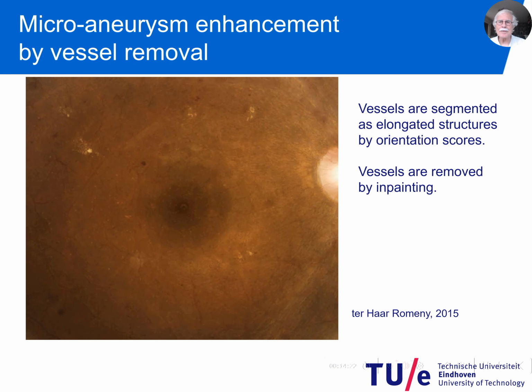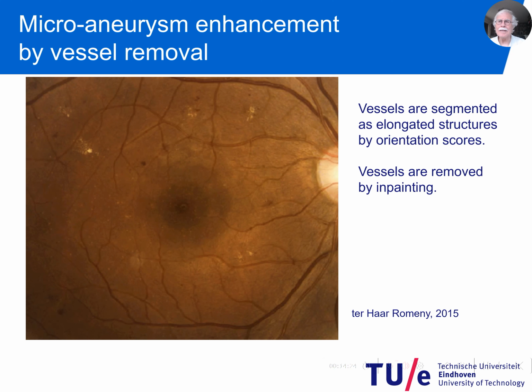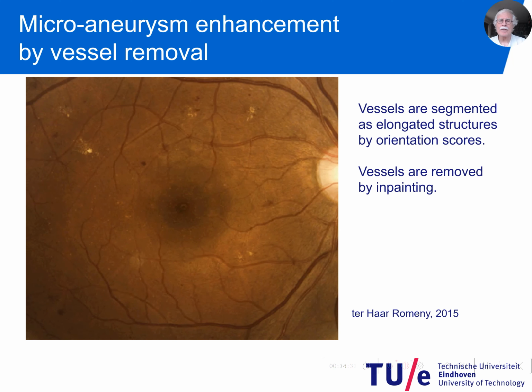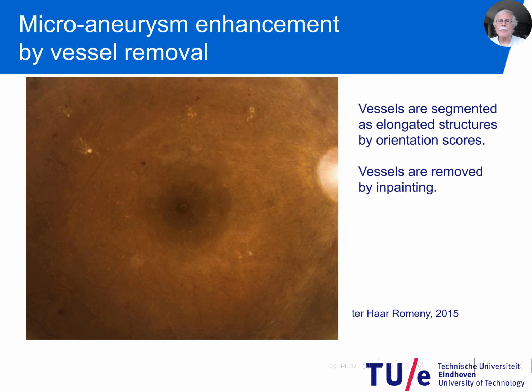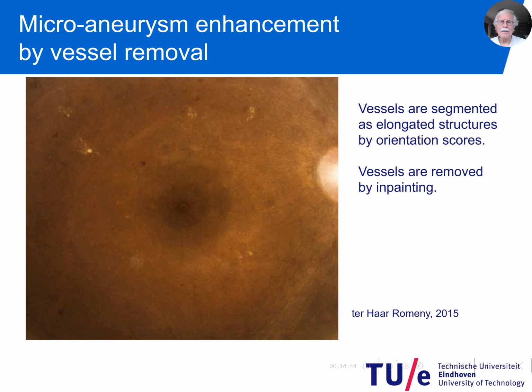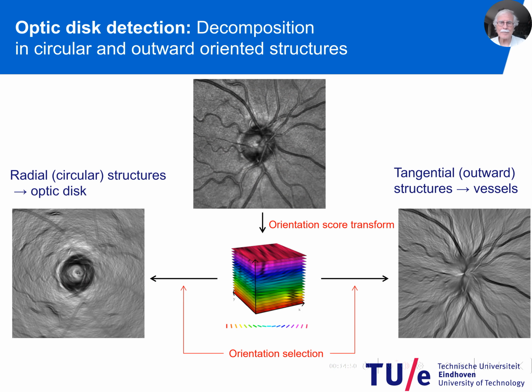If you have blood vessels, we could use the technique of in-painting. And in-painting means that you can remove structures. With AI, you can do it today. That's a very similar technique. And here you see how we remove the blood vessels, and we don't replace them by a blank area, but we replace them by the same statistics as the surround. And it turns out if you remove the blood vessels, it's much better to do a background analysis than with the vessels.